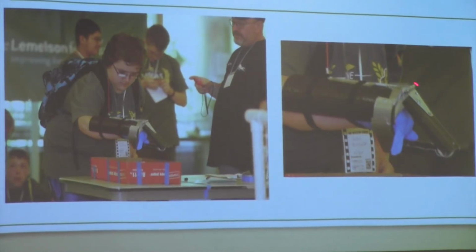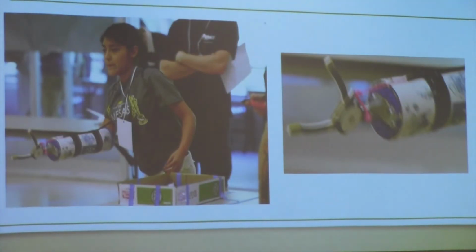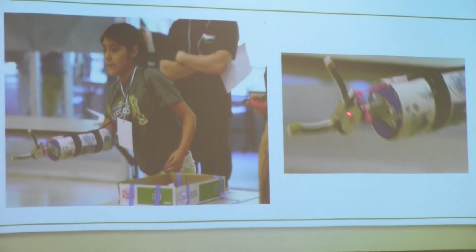It looks like he used a hinge here, and I think this one was flat here. So very creative. Here's another one where it looks like they had 3 steel circular shapes, and it looks like they used that rubber fabric that is used on the gripper. Shelf lining. Yeah, shelf lining, that made it a strong grip. This one I couldn't get a clear picture, but same kind of deal. I think they might have used gears in there. I'm not sure, but there's already a lot of kids that have tried to go out of the box and use different kinds of things.